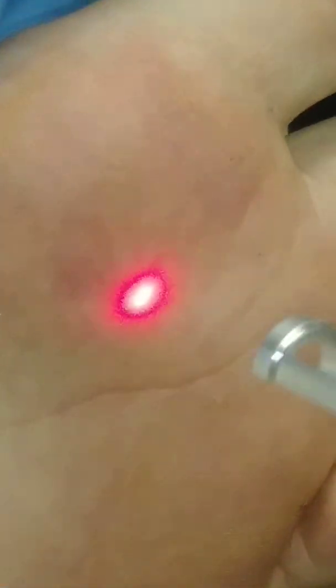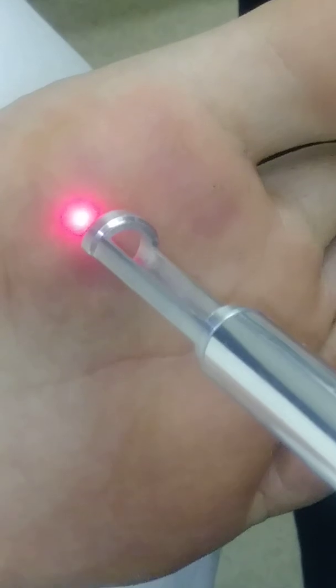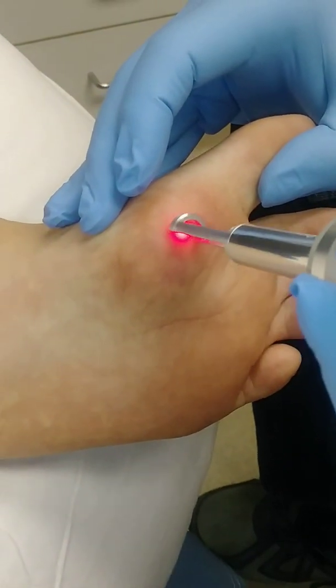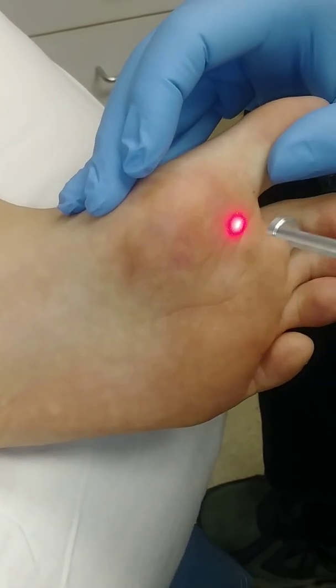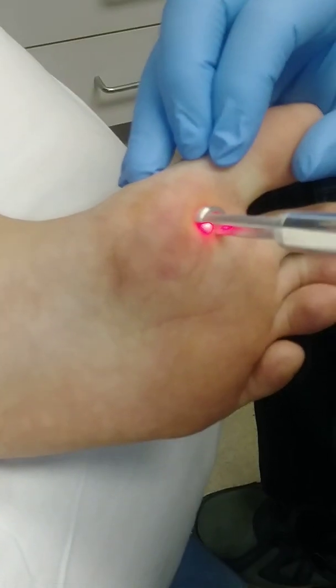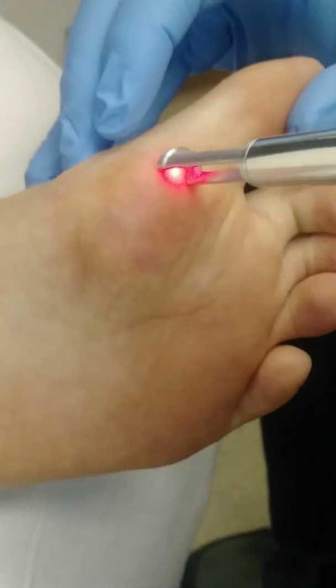I try to give about a hundred shots. We actually went a little more last time because there was more there — we got about a hundred and sixty. A couple of these I'm probably overdoing, but just want to make sure we get rid of them as quickly as we can.